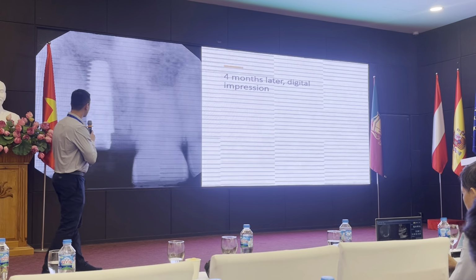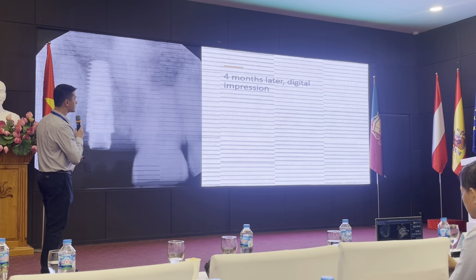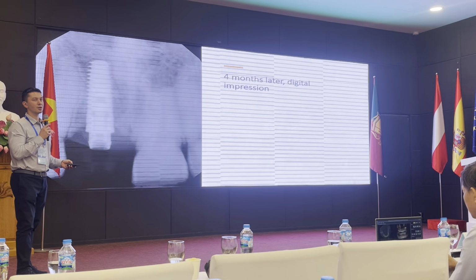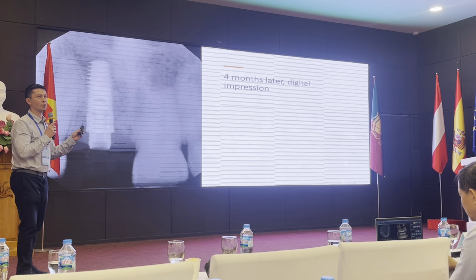Four months later, we're using a scan body here. I wish we were using an encode on this one, but this was before I was using encode healing abutments. And ever since we can use encode healing abutments, I only do it that way because it's so much more efficient.